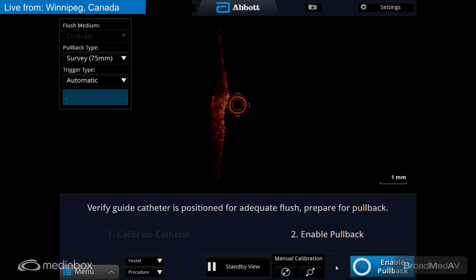So we're just sort of trapping. There you go. And that'll centralize. Come down for me with the balloon. As it's coming down, I'm trying to see if I can get it across. An inch over it. Still fighting you, isn't it? Still not there. There you go. Okay, I think we're good there. Beautiful. All right, let's get the OCT back.